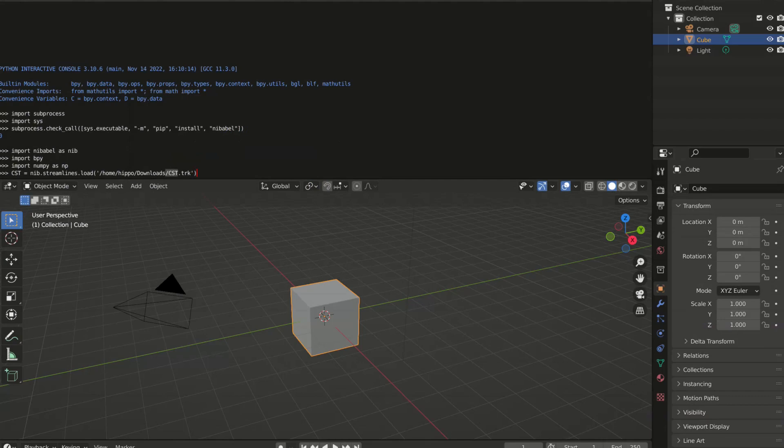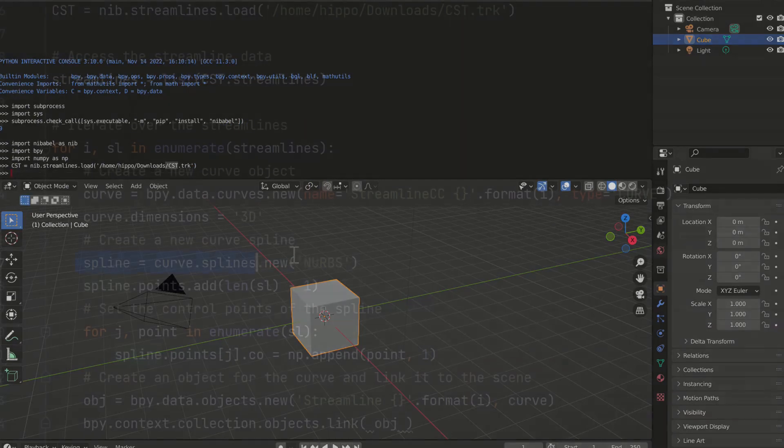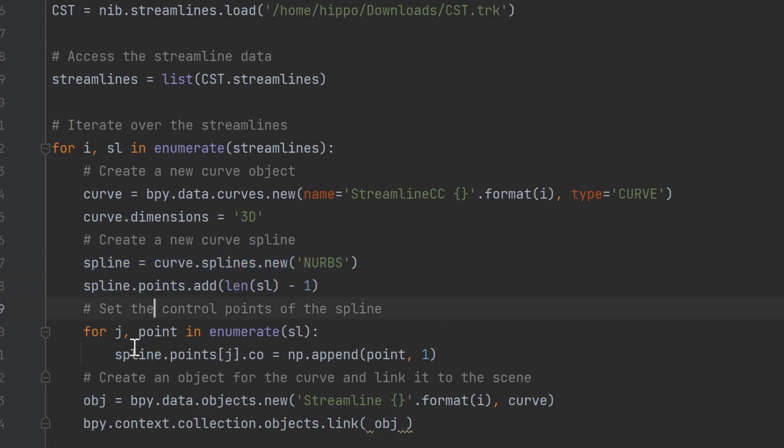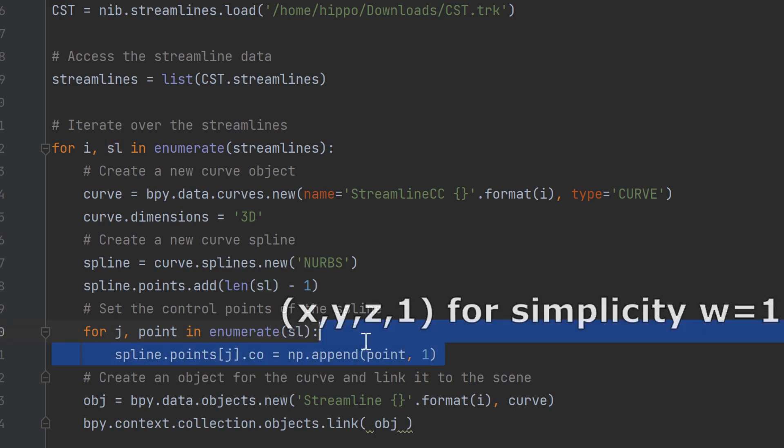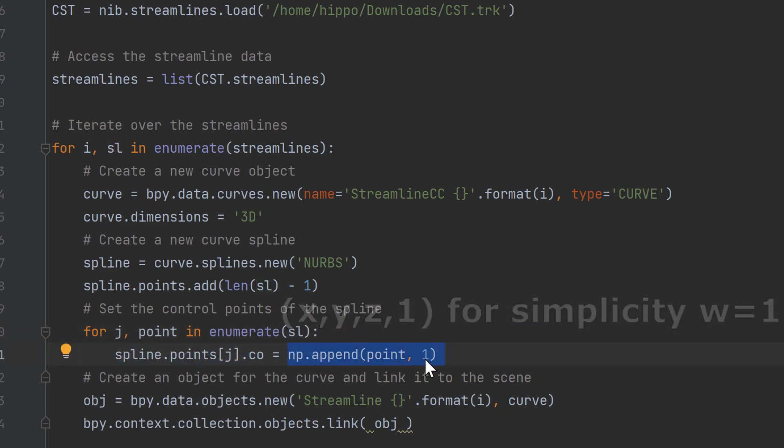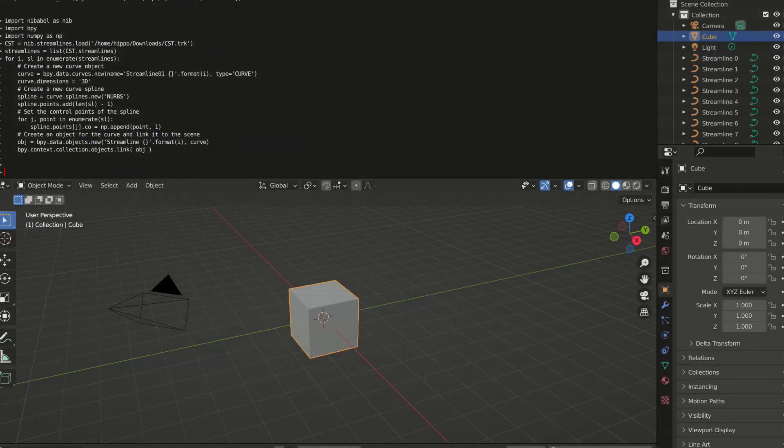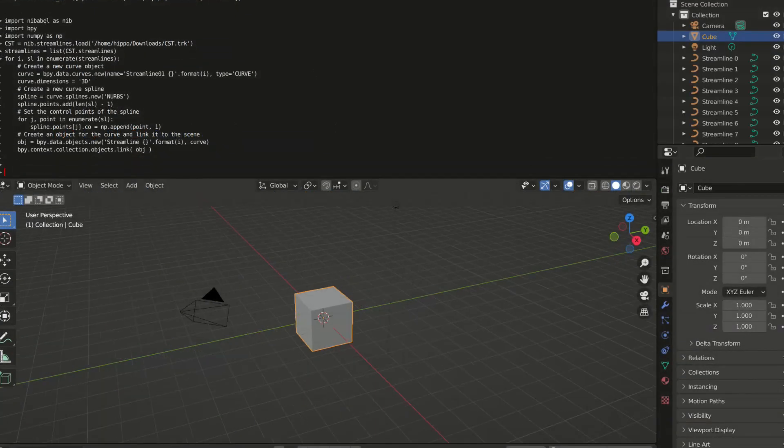Then I convert the points into streamlines into NURBS curves which are a special type of B-splines and I need also to add this another value, another coordinate to that W for the homogeneous coordinates. And now you can finally see in the environment the brain tractography.